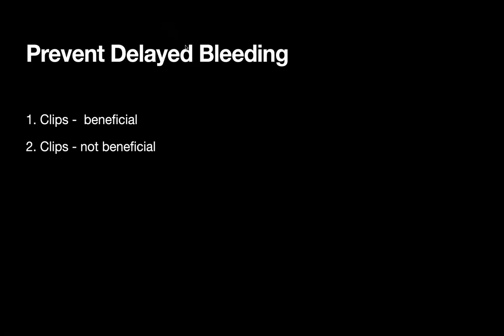I would close it and be done with it. I think that I would close it too. It's a large lesion, although as far as I remember, the patient doesn't use anticoagulant therapy or things like that, but it's still a large lesion, so I would prefer to close it. I think it's right side and it's large.